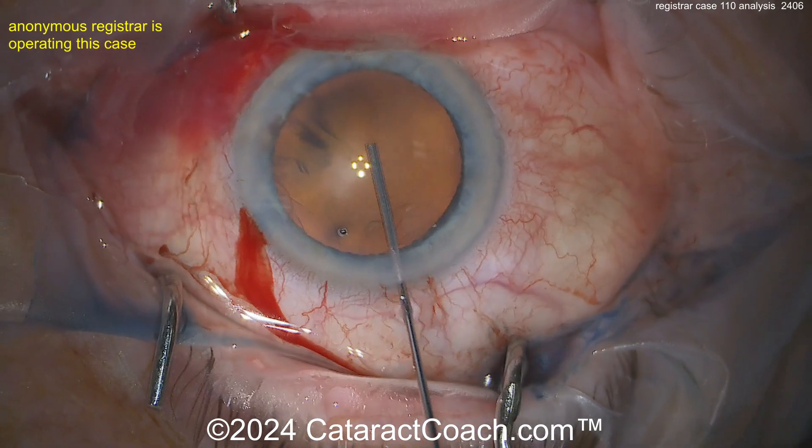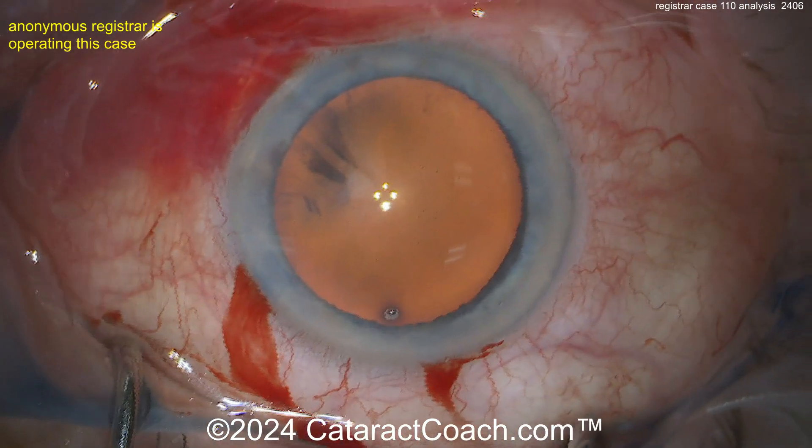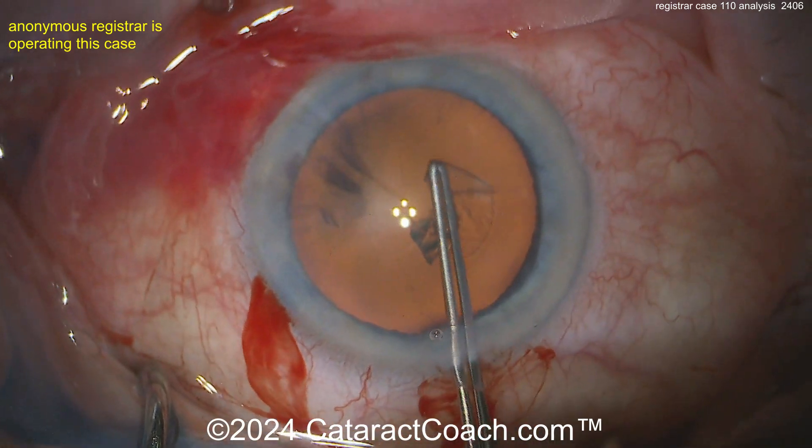Here's our viscoelastic going inside the eye. I'm not sure you need trypan blue dye in these cases — yes, it makes the capsule a little less elastic, perhaps easier, but you've got such a great red reflex here. I don't really see the purpose of the trypan blue, so you may want to stop using that.